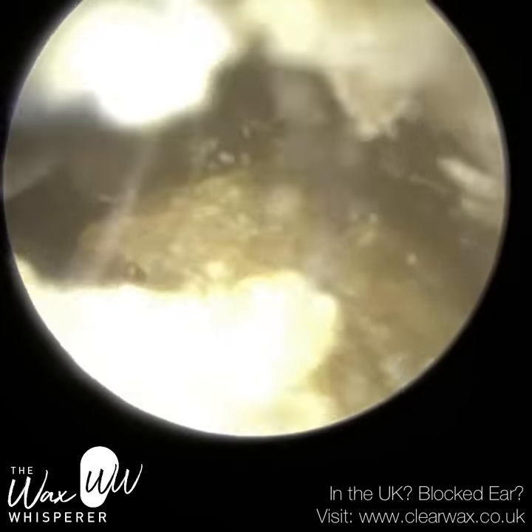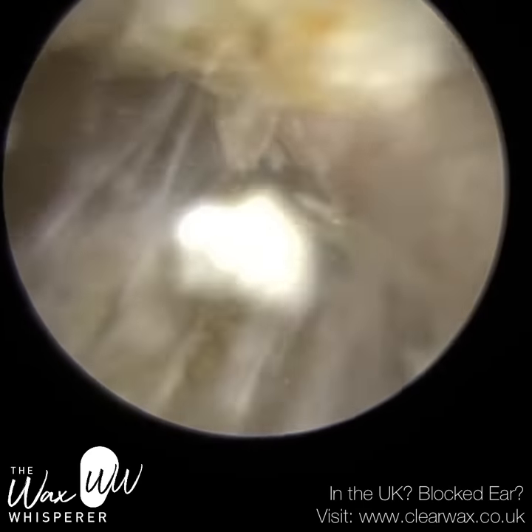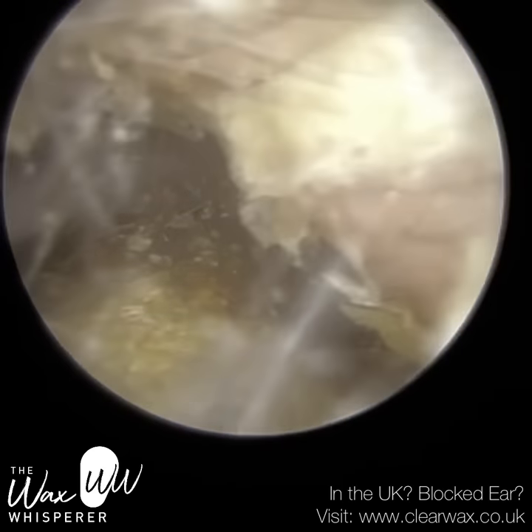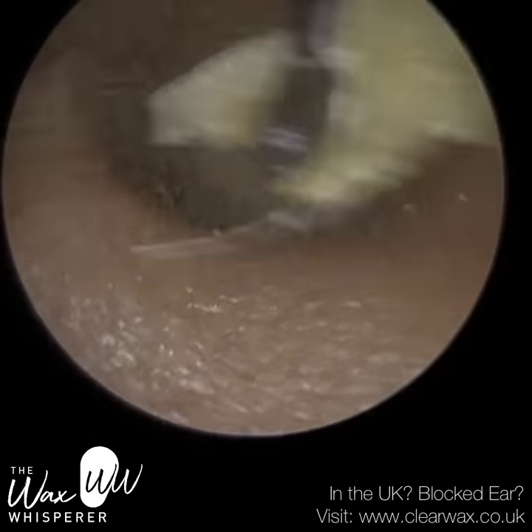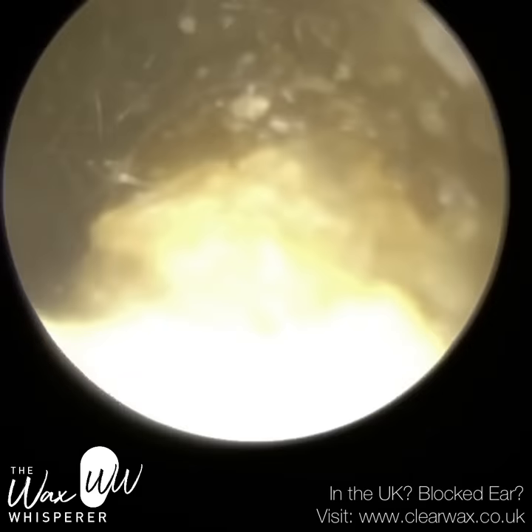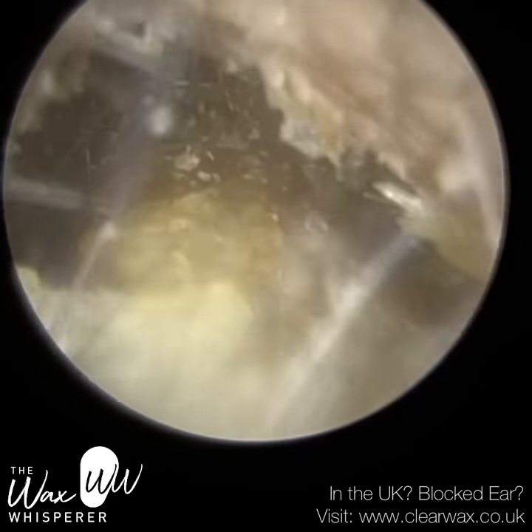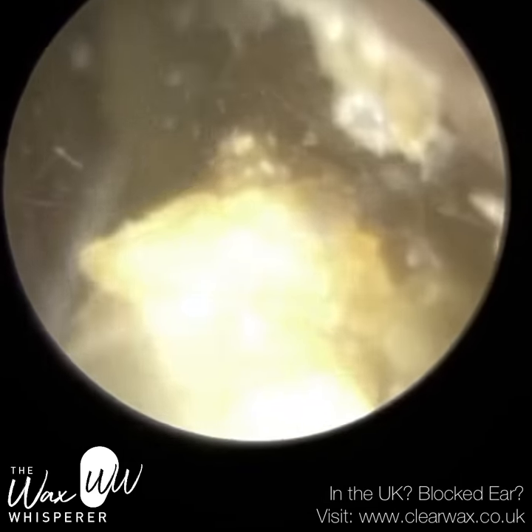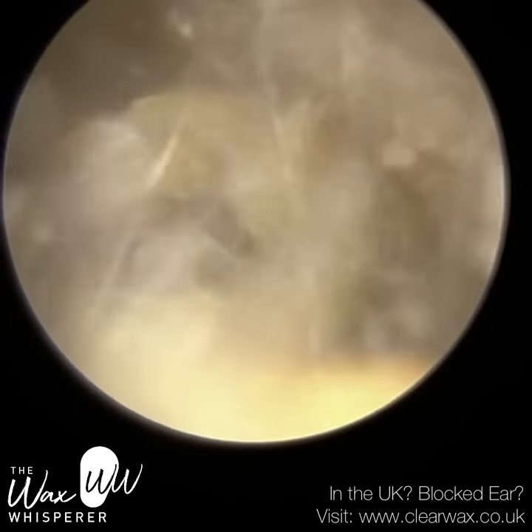We've now moved over to the patient's right ear. Similarly to the left, I've immediately used the ear hook. There's a bit of dead skin that I just used the side of the hook — the L bend. The ear hook looks like a hockey stick and I was just using the side of it to glide that dead skin out.